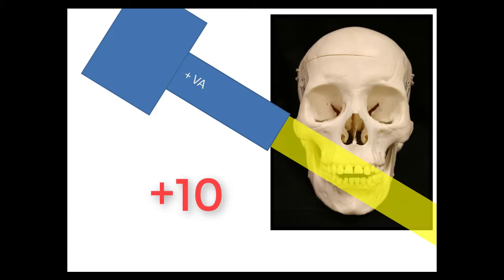Once the receptor has been positioned, set the tube head. A vertical angulation of positive 10 degrees is recommended for bitewing images. If the tube head is directed downward, the vertical angulation is termed positive angulation. Therefore, in order to set the tube head at positive 10 degrees, it must be moved downward to number 10.